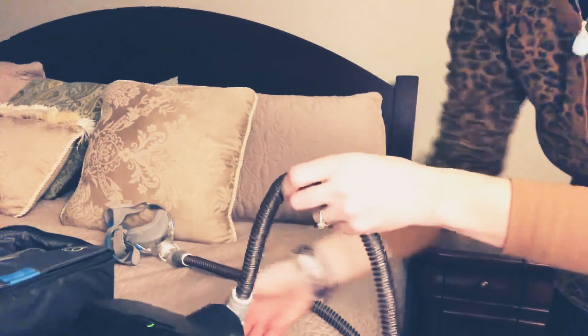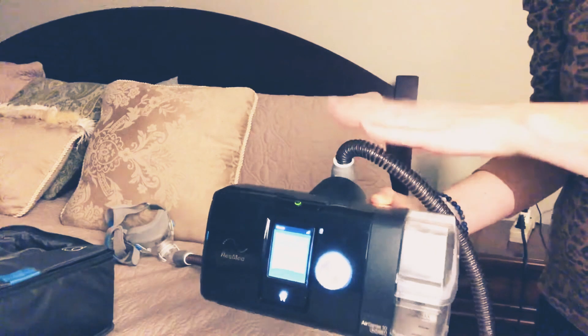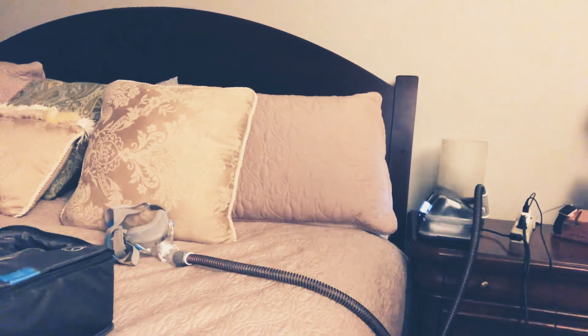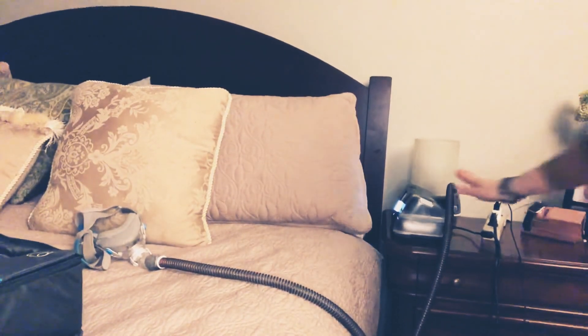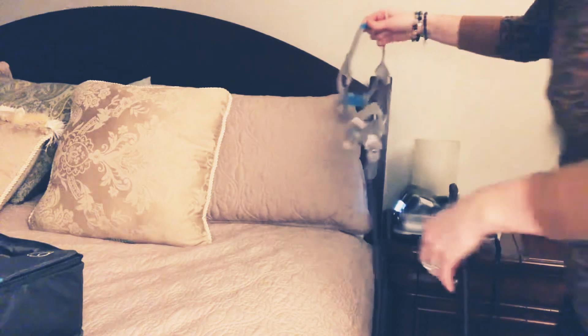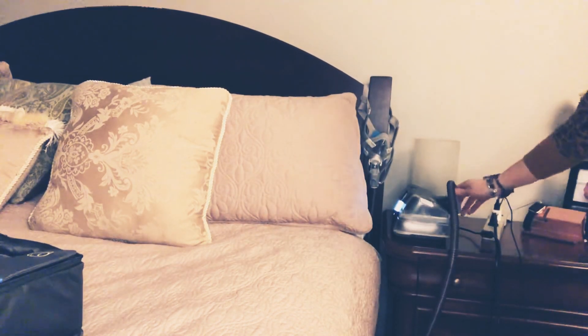I always recommend when you're using your CPAP to have it in the upright position. It does have a swivel, but I find that's the best way to have it. You want it on your nightstand so it's nice and level to your bed. What I like to do is take my mask when I'm not using it and hang it up like that.